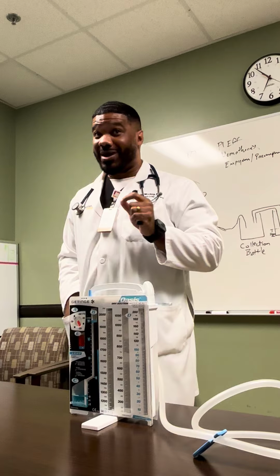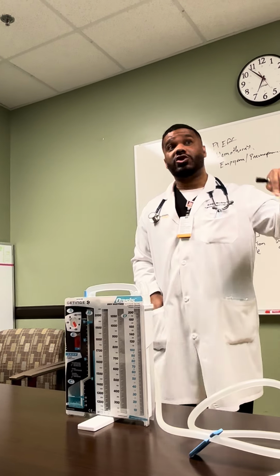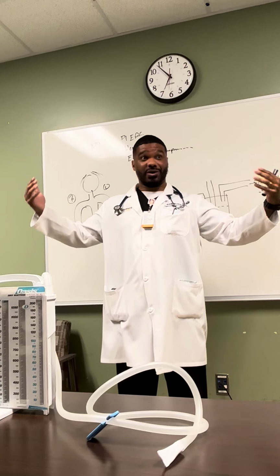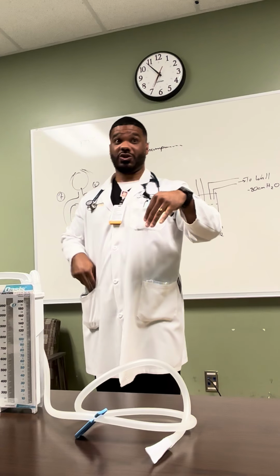Another thing that I want to empower you guys to do is start assessing the chest x-rays yourself. You guys have access to imaging just like we do. When they come around to do a daily chest x-ray, that's something you should always take note of. Patients with chest tubes should get a daily chest x-ray to make sure that the chest tube is in place.